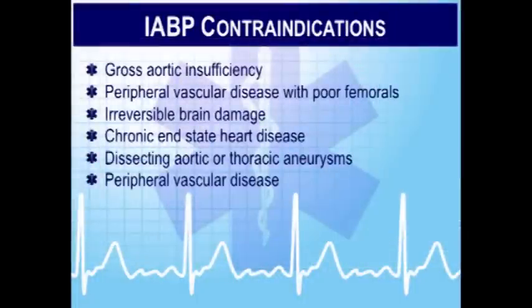So peripheral vascular disease, they're at risk for injury to blood supply to their lower extremities. So that's a big risk factor for patients with femoral pulses. As a matter of fact, there's actually a Doppler. You guys know what a Doppler is? For assessing pulses built right into the balloon pump so that you can frequently, every hour, check the distal pulse because it's such a big deal, because that catheter is so big.